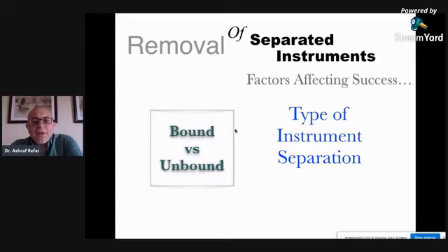That means the amount of dentin in contact with these flutes is much less, and the amount of engagement of the dentin is much less. On the other hand, you may have a bound instrument, and this usually happens when dentists try to force instruments inside canals. These instruments bind much more aggressively with the dentin and are definitely a lot harder to remove compared to unbound instruments.